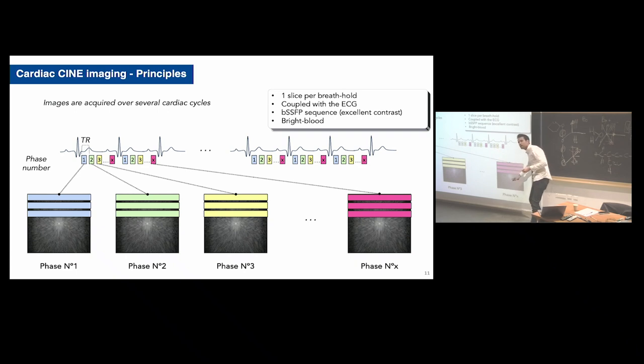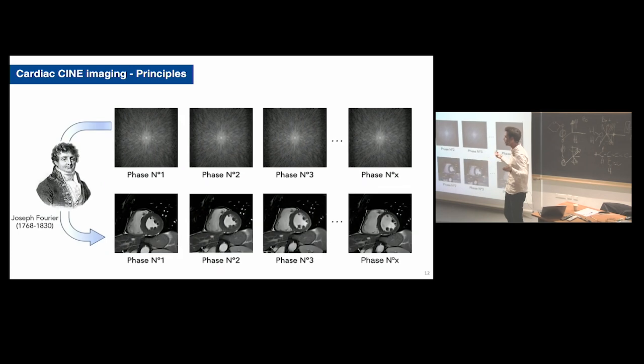So guess how we're gonna now get the image from this k-space? Someone? Very easy. The Fourier transform, right? Super easy. We apply these beautiful mathematical tools from Joseph Fourier. Anybody knows where Joseph Fourier comes from? Marseille? No. From Auxerre. He's a French mathematician, and this is amazing what he did in the 1800s, right? We did not have MRI at this time.